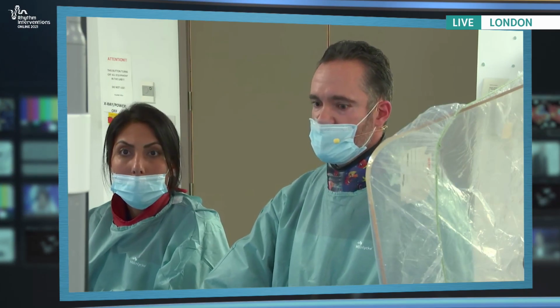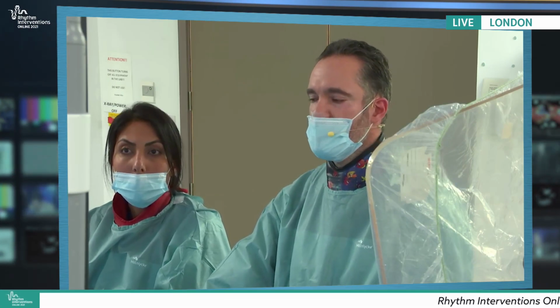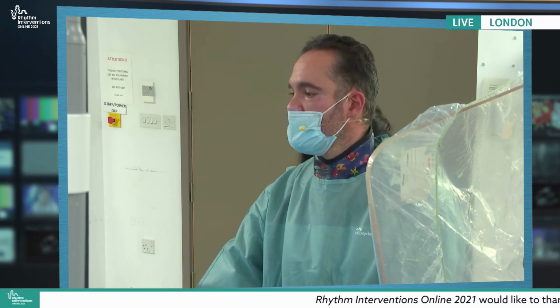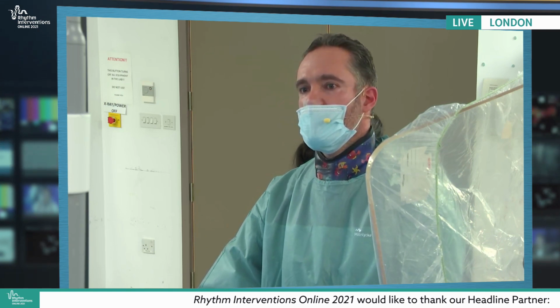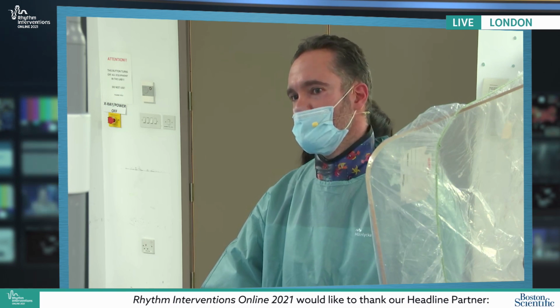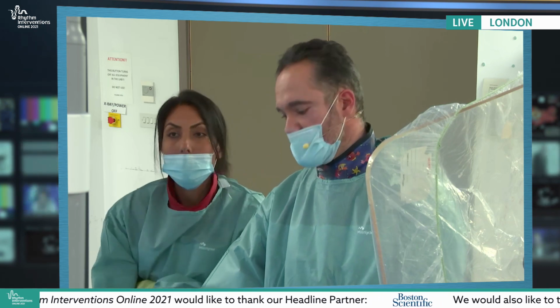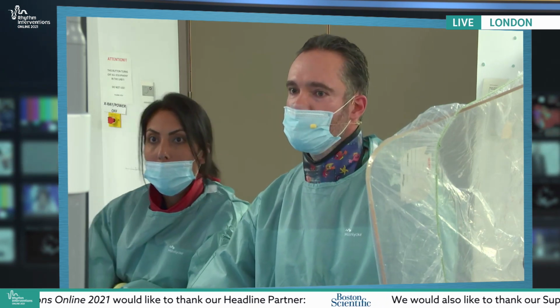Well, we do waiting times though, and I was going to ask Ross, what about especially in redo cases? Do you do waiting times? How long are they before you pull back? Yeah, I suppose it depends a little bit on what we find and what else we've done. I think we started the case about 5:45, so we've been going just over, or coming up on, an hour and a half or so. We isolated the left veins a good 45 minutes ago maybe. And even the right veins, by the time we've done our mapping and our CTI, I would argue that we've done a little waiting period already.